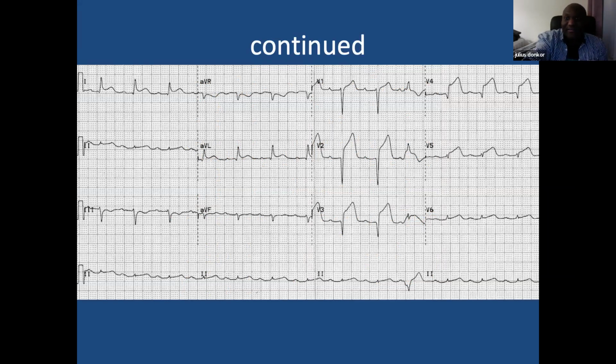And it's got a slight lateral extension. So it's anterolateral MI actually. And you can clearly see reciprocal changes in your inferior leads there. You can see that in lead 3 and also in lead 2, so much more in lead 3 and AVF actually. The level of ST elevation in anterolateral isn't always equaled by the level of reciprocal ST changes.